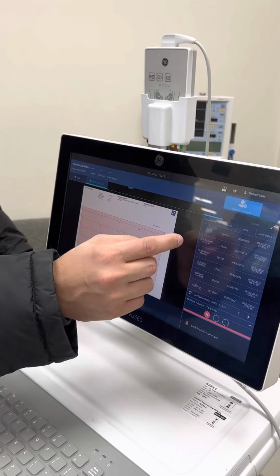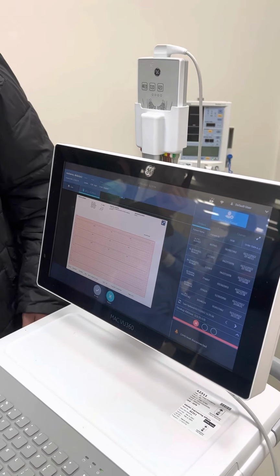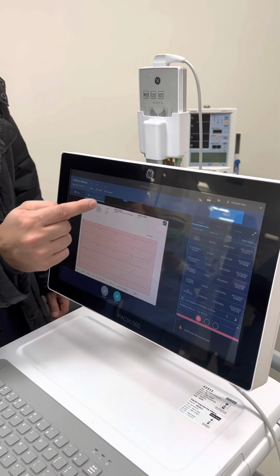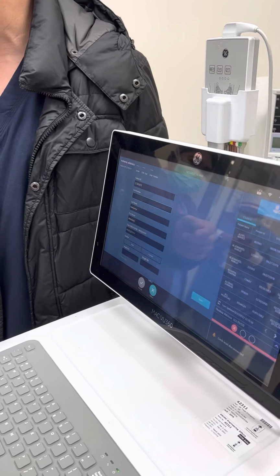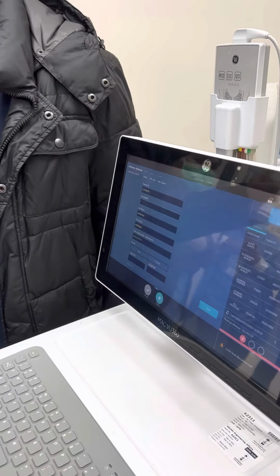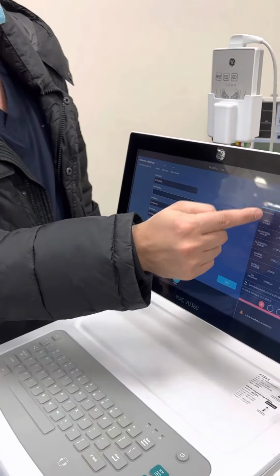The third workflow, if you have no time and the machine is needed all over the department, just put a hint and note the time. So similar to what I put here for my patient, I put from 1 to 8. And later on, I will get back to it. After placing the order, I will attach the order to my report. Then do the transmit. Okay? So the order list is showing up in here.